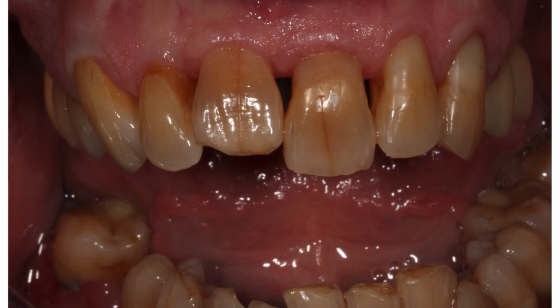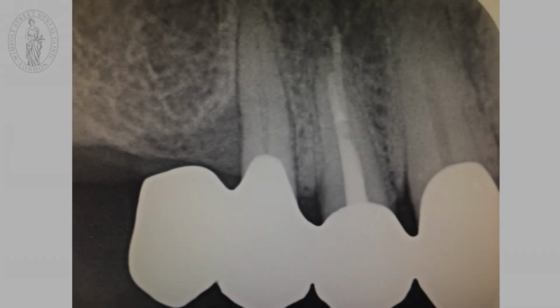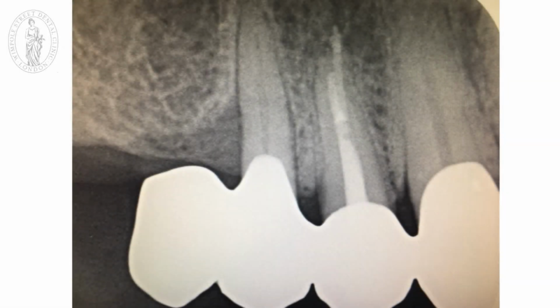So I'm very pleased with that result, although it's not just a white fence of beautiful American teeth. Here the detailed picture, and you can see perfect color. I was really pleased with the result on the day, and the patient, of course, was very pleased as well. The x-ray at the end shows that the margins are all perfect, no infections from the teeth, and of course we have to get the patient to properly brush this bridge. And these were the conventional bridges.